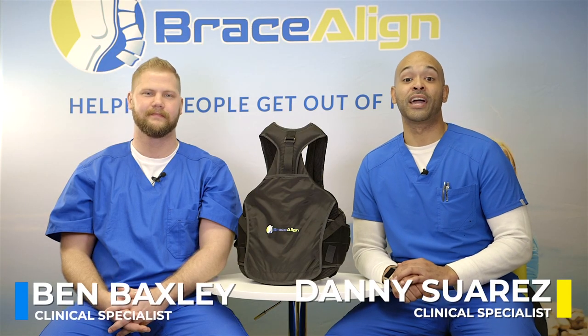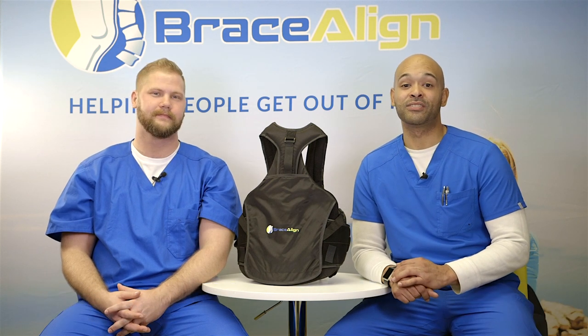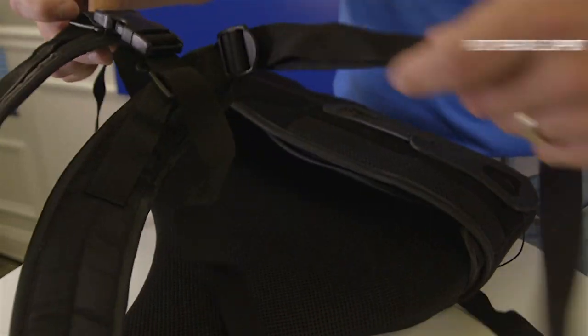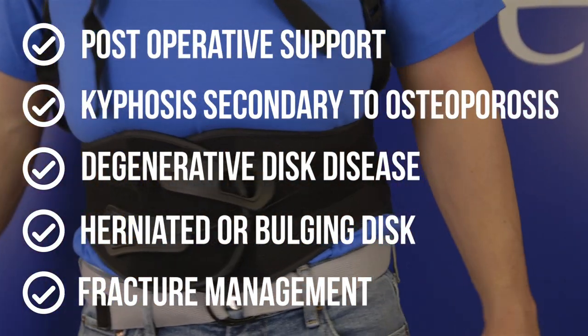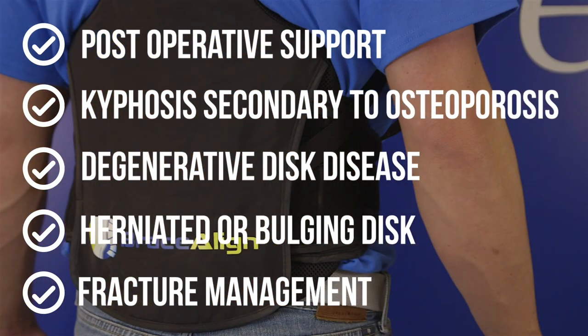Thank you for choosing Braceline's Vertebraline TLSO. This medical grade back brace is commonly prescribed for patients with back pain, for postoperative support, kyphosis secondary to osteoporosis, degenerative disc disease, herniated or bulging disc, fracture management, and other spine related issues.